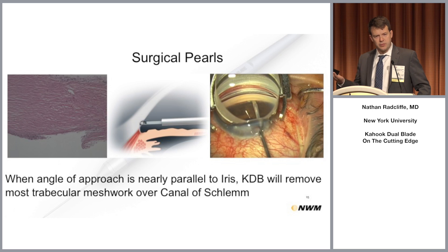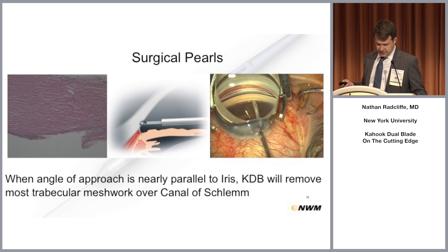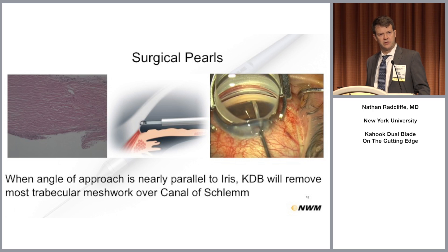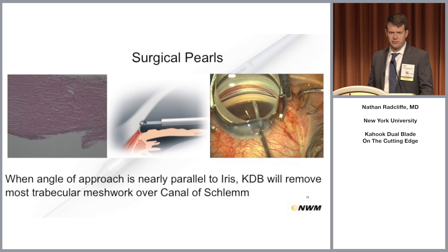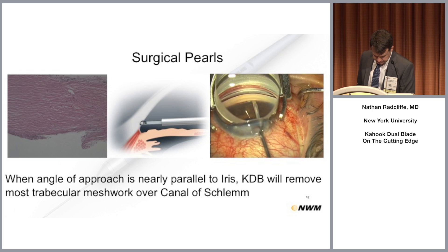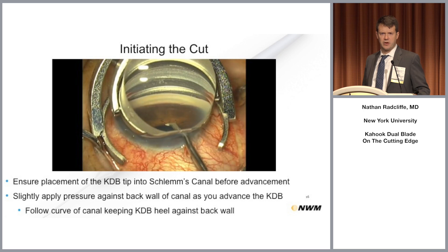You want the Kahook Dual Blade parallel to the iris to get in. If you come too far above, you won't be able to access the canal of Schlemm as well. Come right across the iris — you don't want to burp your wound with the instrument, so pay attention to what's happening. Remain wound neutral, rotating the instrument with the axis of rotation basically inside the clear corneal incision. Then initiate the cut, going a little off-center to get as much trabecular meshwork out as possible.